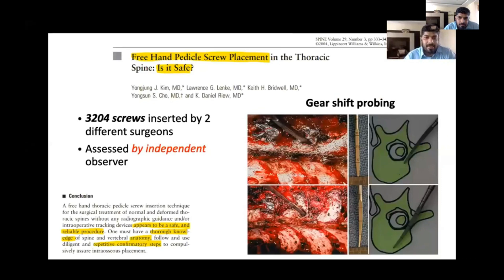Gearshift probing is always useful in freehand technique because it gives safety towards the cord. When we enter, we cross the pedicle. Once we cross the canal, we can turn it around towards the vertebral body following the D-shape vertebral contour and go with more convergence. Therefore, this gearshift probe is very, very useful.